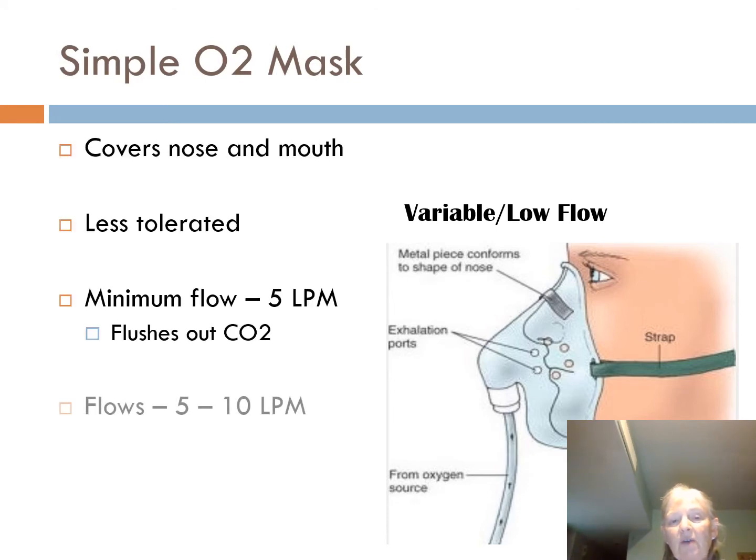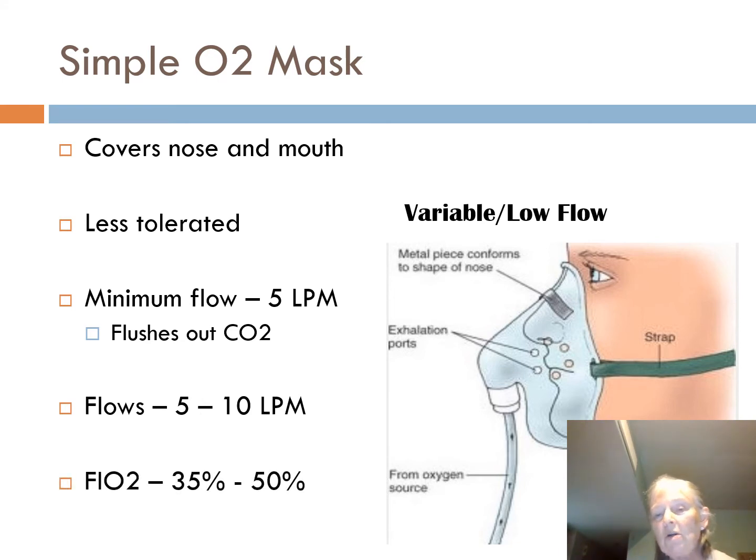The reservoir devices are your mask, okay? And part of the reason we call them reservoir is they can actually hold a little bit more oxygen in these areas, okay? And you can see this is a simple mask. And when I talk about this, I tell the students all the time, it's simply a mask. That's all it is. It has the tubing that comes up to it, a little thing that goes into it that you hook into it. And it is a mask, and that is it.